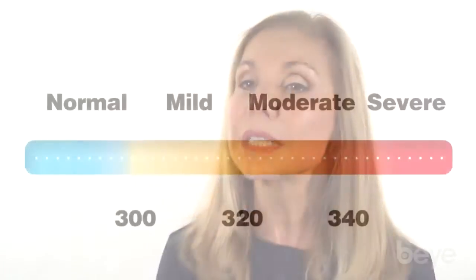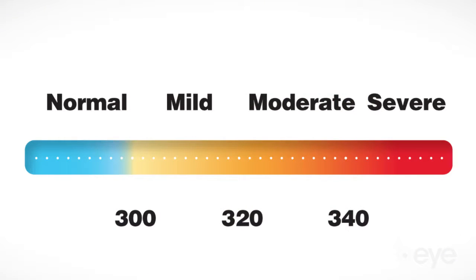Some patients are asymptomatic, so it's very important to also order this test if you see any type of lid margin disease or staining for a future visit. Tear osmolarity of 300 and below is considered normal. The higher the number over 300, the more severe the ocular surface disease. Moreover, if there's a discrepancy or interocular difference of 8 milliosmoles or more between the two eyes, that also reflects tear film instability. So all of these are points that we can share with our patients.